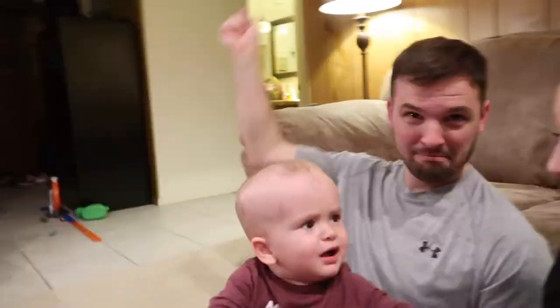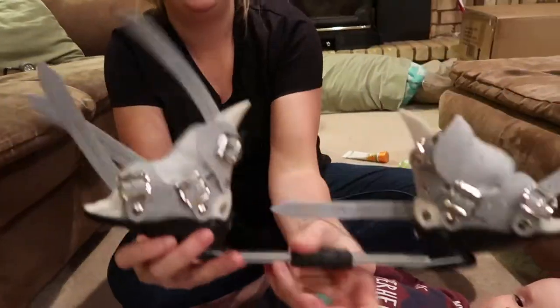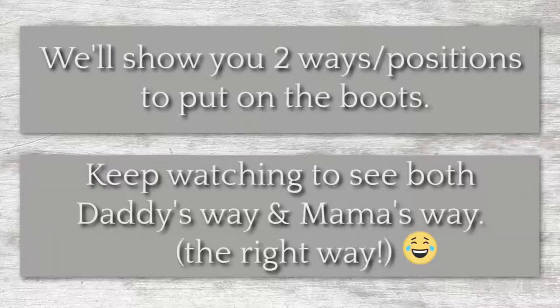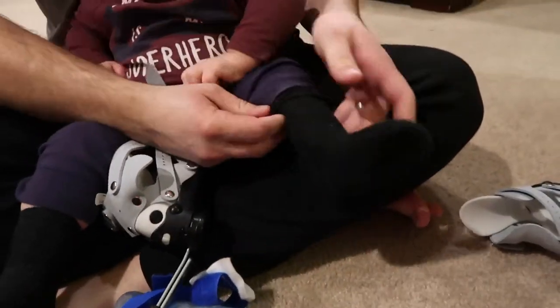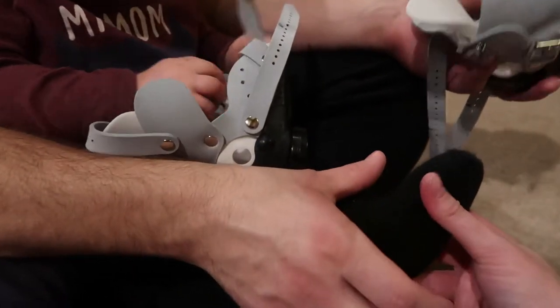It looks like this — it'll have the buckles on the inside. This is the Ponsetti. This is daddy's way to do it — the only way to do it, right buddy? You want to make sure his sock is completely pulled up, because if it's not he will get some blisters and it'll rub and stretch his foot.